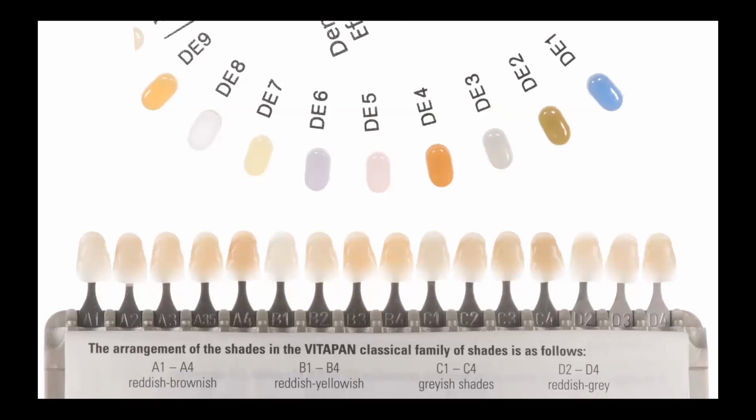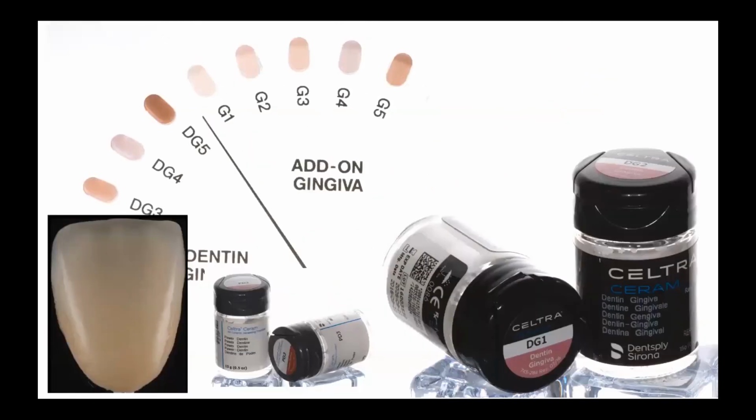For example, group of shades A is reddish brownish, so we can increase the presence of the red shade if we add some pink dentin effect DE5, or we can increase the yellow shade of group B if we add D7, the yellow one. We can use a mixture of power dentin, the element of our veneering porcelain with increased chromaticity, with the gingiva dentin, and this mixture is very aesthetic when we apply it on the cervical aspect.